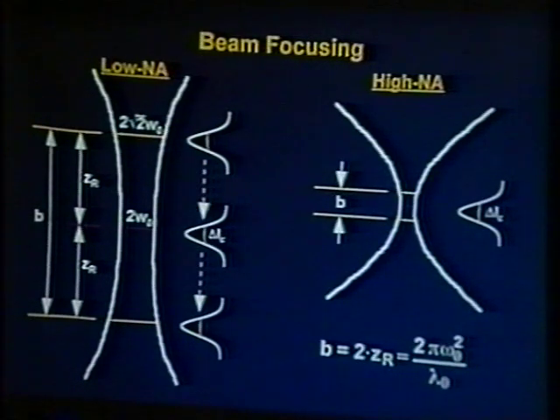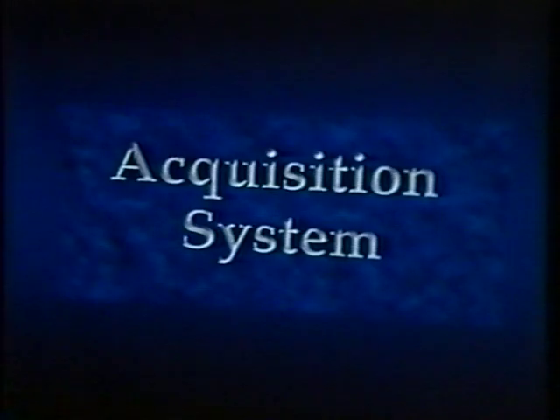Superluminescent diodes, we have human-based systems that we're looking at in the esophagus and the cardiovascular system that are currently, the source is a quantum well device related to the superluminescent diode. Now, most of the in vivo data and all the high-resolution data was done with a Kerr lens mode-locked chromium forsterite laser, which had a bandwidth of approximately 180 nanometers. Unfortunately, this isn't a clinically viable source because it's too complex and expensive for routine clinical use.